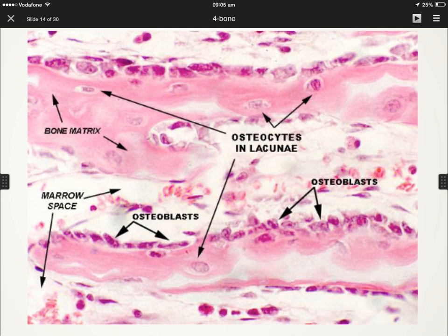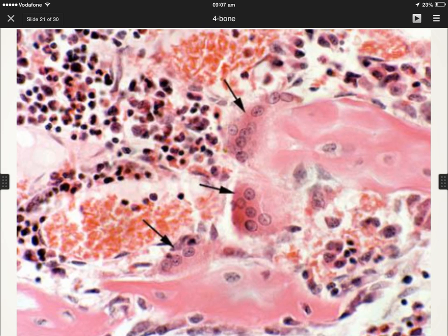After that, we have the irregular bony cavities, which are full of the different cells responsible for hemopoiesis. This is the bone marrow cavity, and you may be asked what the type of this bone marrow is. It is red, because it is present in the spongy bone, so it is a red or active bone marrow. So we have here osteocyte, osteoblast, bony trabeculae or bony matrix, bone marrow. Another nice picture for 3 osteoclasts.